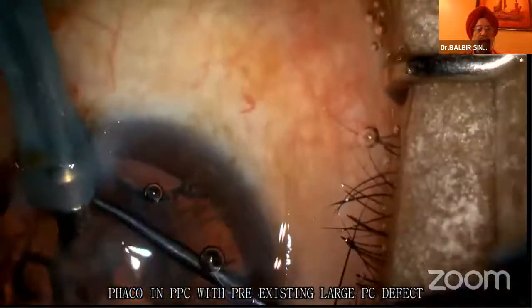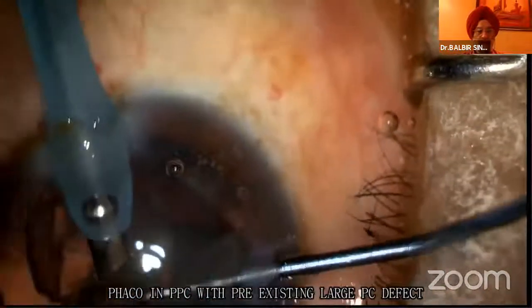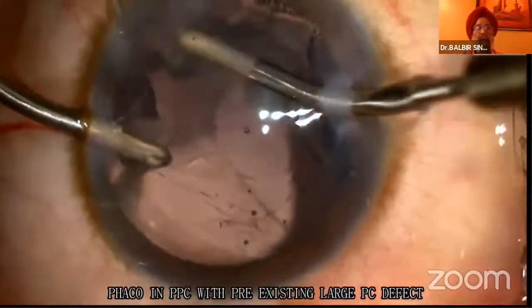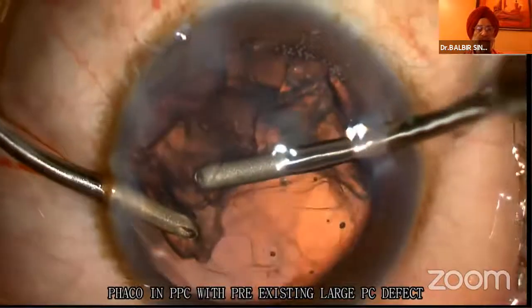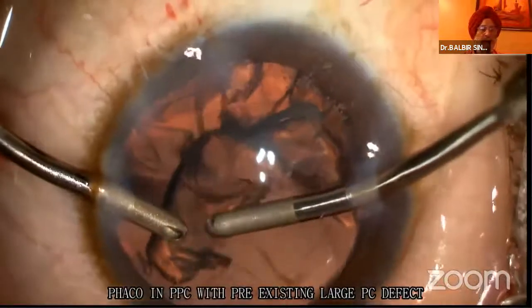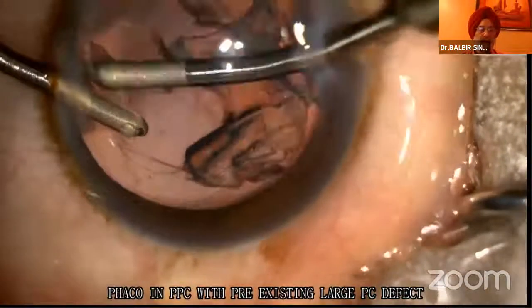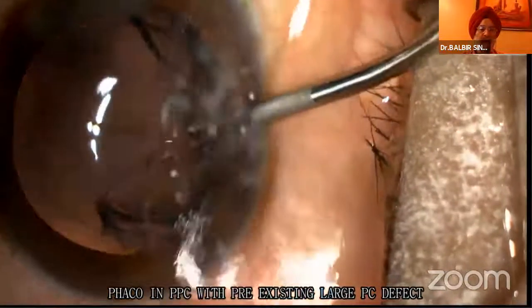And this was similar in the 2 cases which I have come across in my life. I'm sorry for the decentering. Now, with bimanual irrigation aspiration, again I am trying to remove the epinucleus from the periphery to the center, avoiding the central part, and removing the epinucleus away from the tear, which is very clearly demarcated. The edges of the tear are thickened, which you will shortly see.